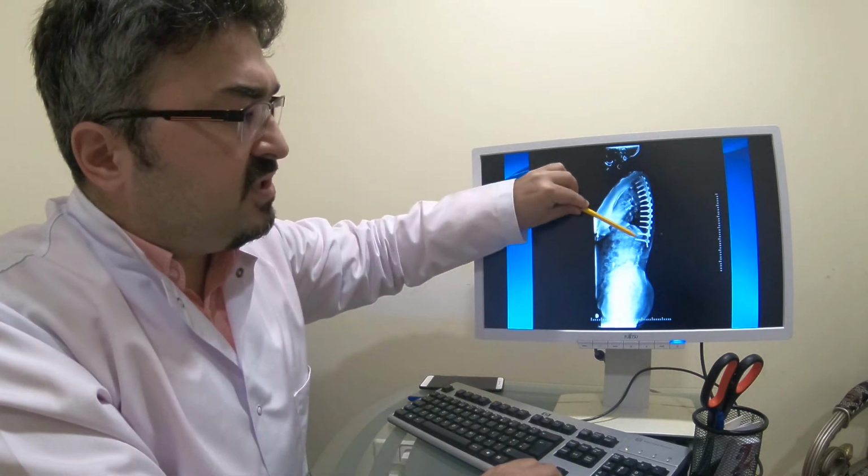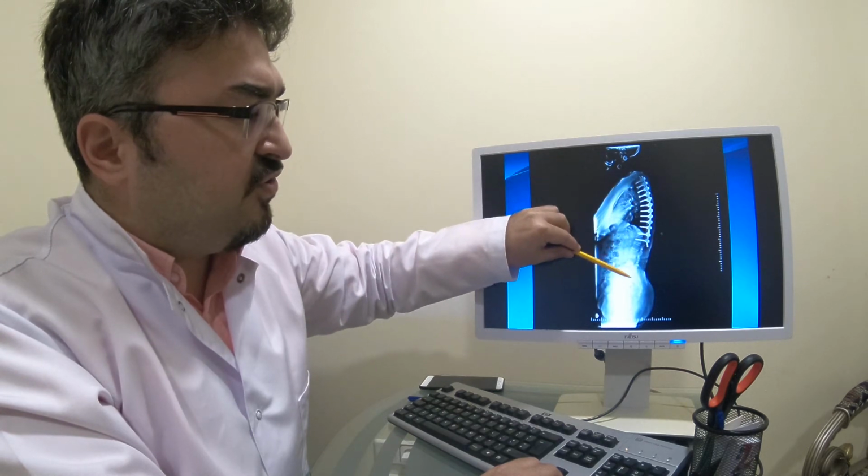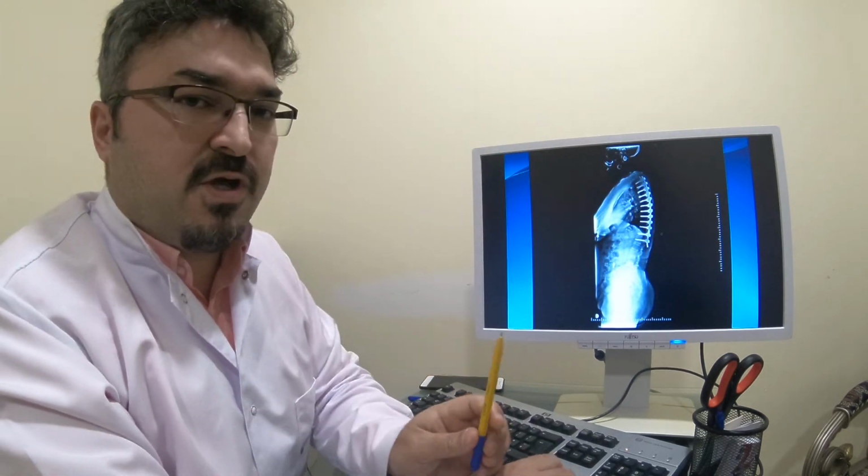We did posterior instrumentation for this patient and you can see how the curve has corrected to a natural one.